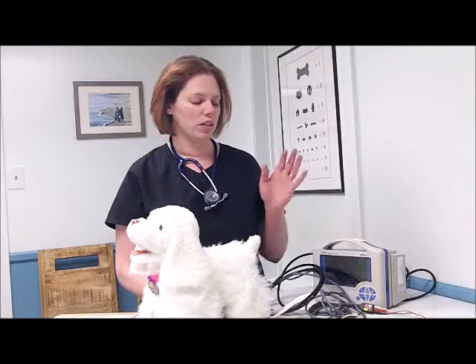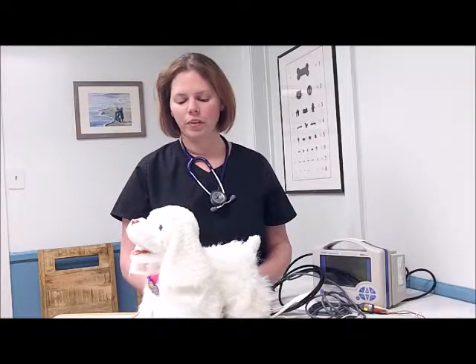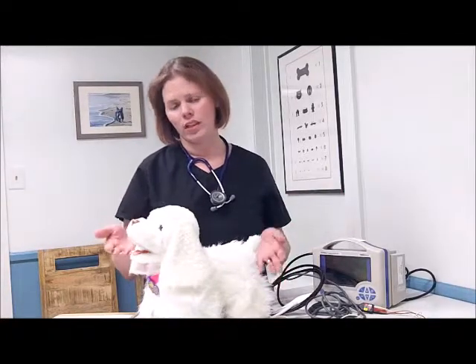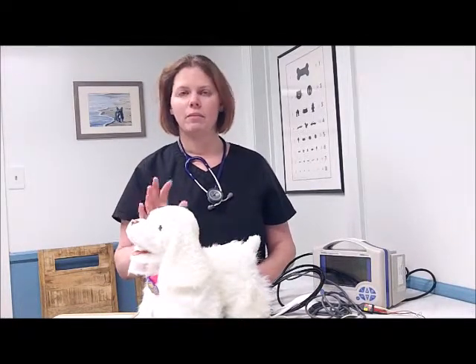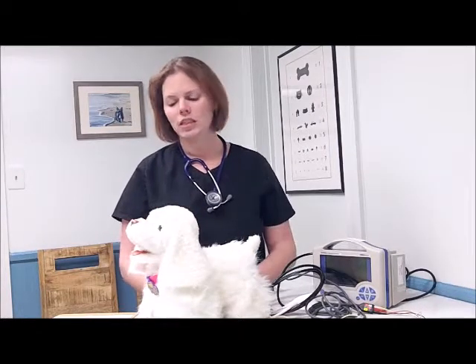You would also notice a decrease in our pulse oximeter. That should also be a part of your ECG setup. You should notice that first before you even get to the point of having those bluish tinged gums. It's not the best parameter for perfusion, but it is definitely one that can be used.